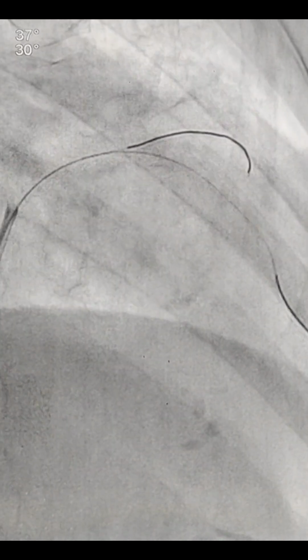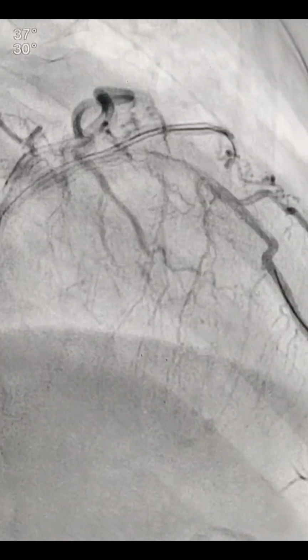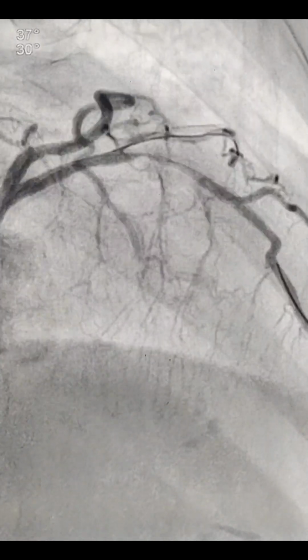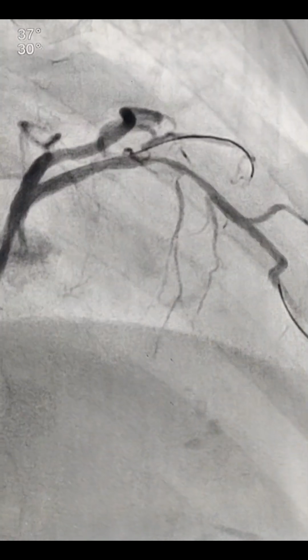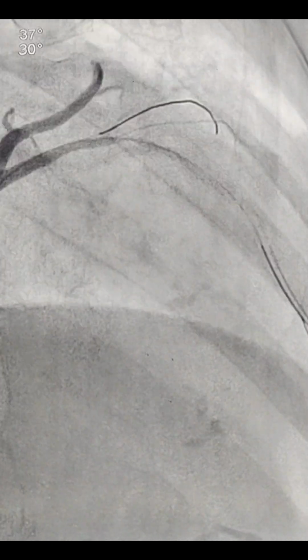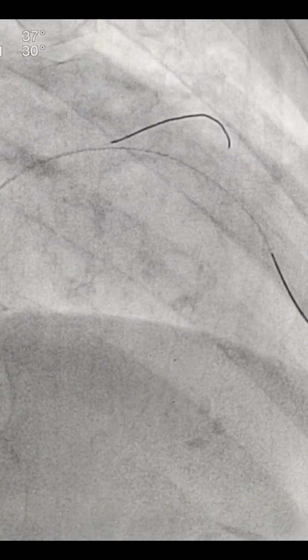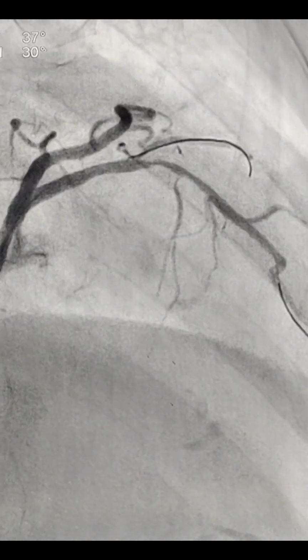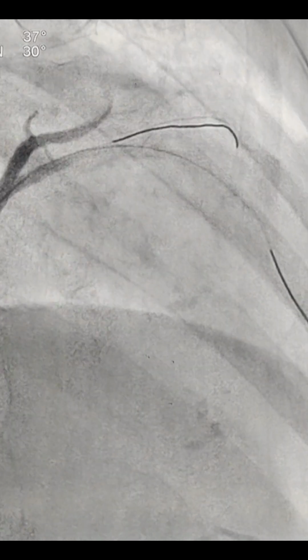So here in this LAD, there may be a difference of opinion. From the mid LAD, there's a size of 2.75, and in the proximal LAD, there was a size of 3. So we decided to take two stents, one in the mid LAD and one in the proximal LAD, to get a better size, because the proximal size was 3 and the mid size was 2.75. So with this right femoral route, we started.